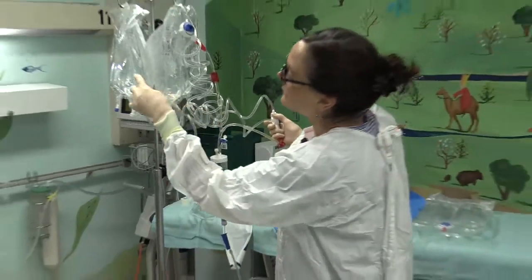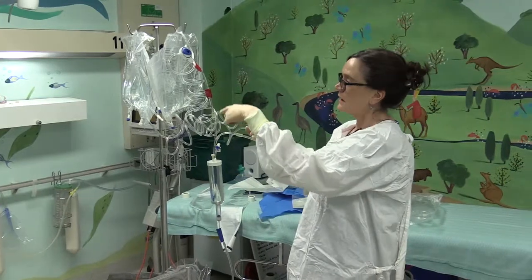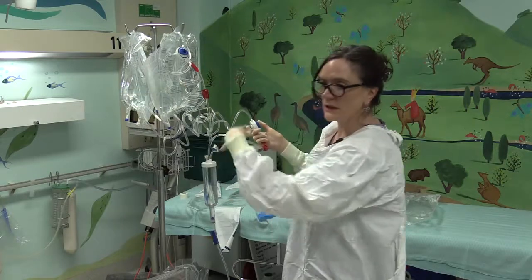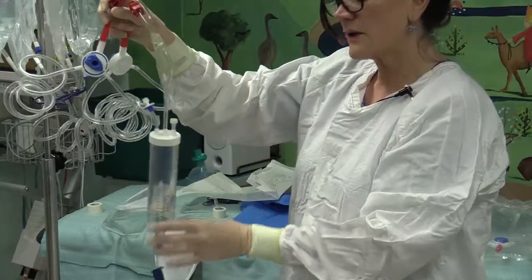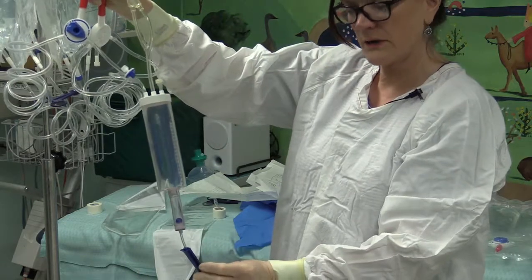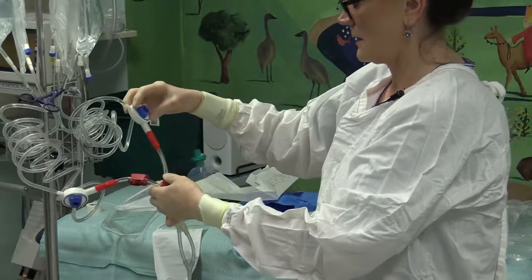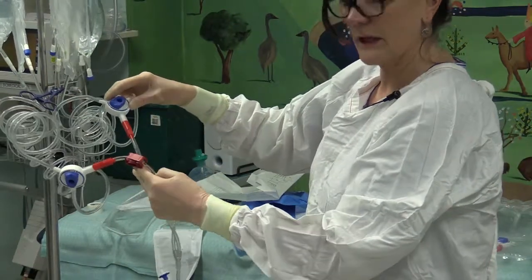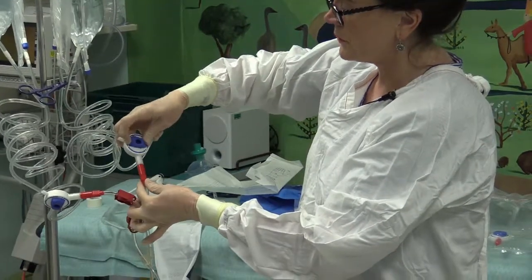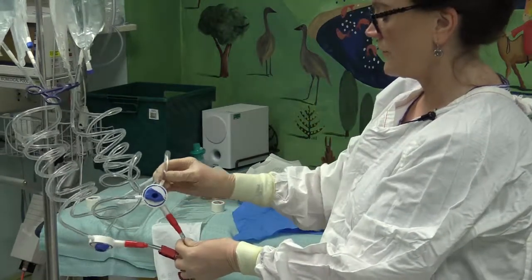I need to prime the 2.3 bag the same way as I primed the 1.5 from the bag into the drainage, just to clear the air. Now I'm going to fill the burette, making sure that the roller clamp at the bottom is closed. I open the clamp, the red clamp, and I turn the dial to number 3, and it will fill.